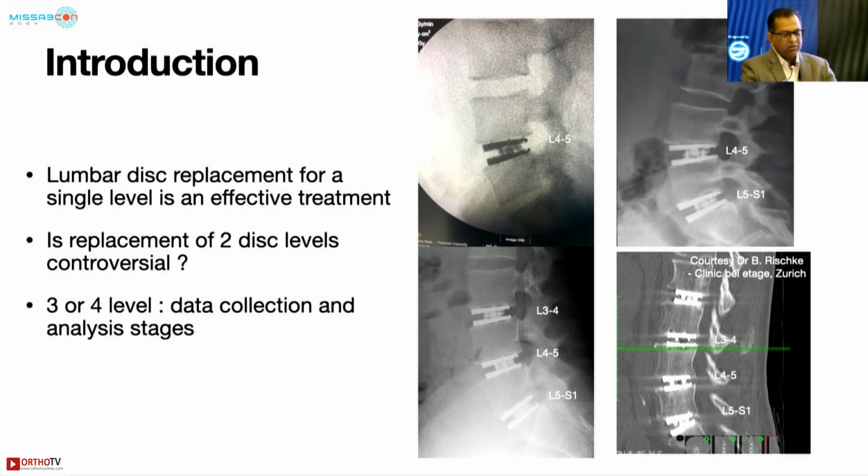I will be talking about the viscoelastic devices in this paper. It's the second generation of devices. We are no longer doing a mechanical device like ProDisc, Charité, Baguera, and a lot of other mechanical devices. These are all single piece. They are all designed like a ball-and-socket technique. What you cannot see between these two metallic end plates is a viscoelastic core, and you can see the micro stabilizers over there.